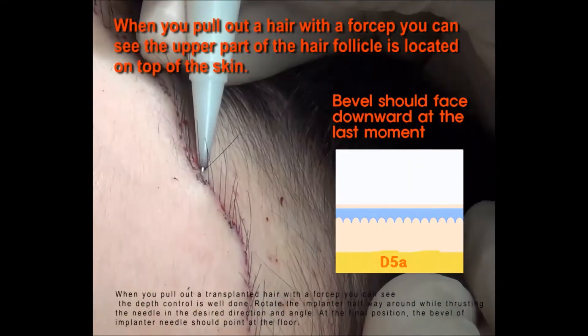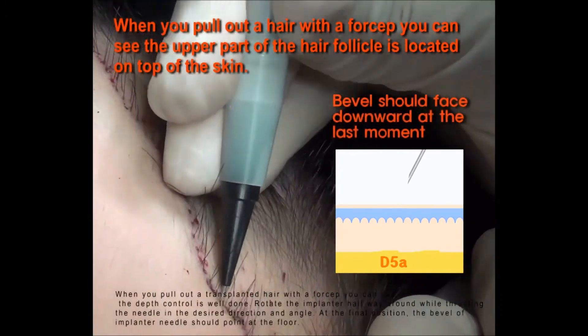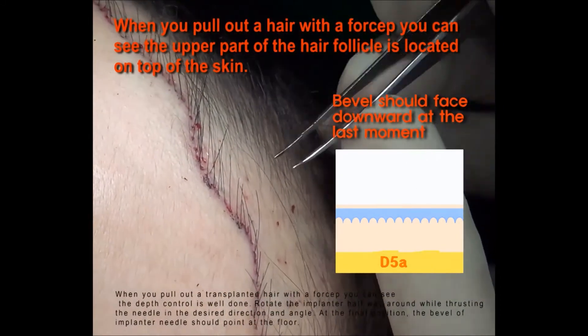Rotate the implanter halfway around while thrusting the needle in the desired direction and angle. At the final position, the bevel of the implanter needle should point at the floor.